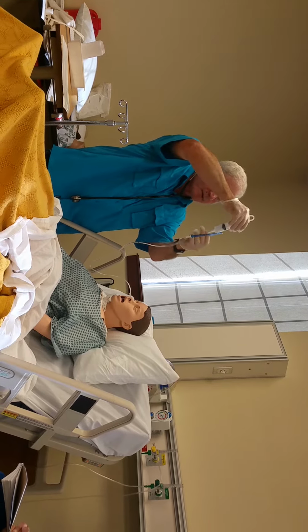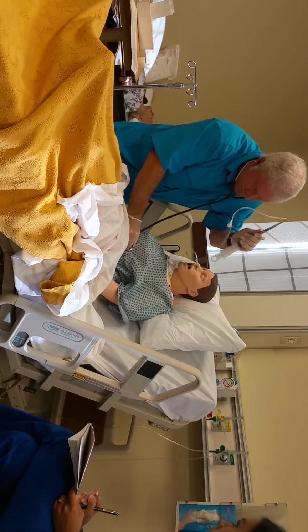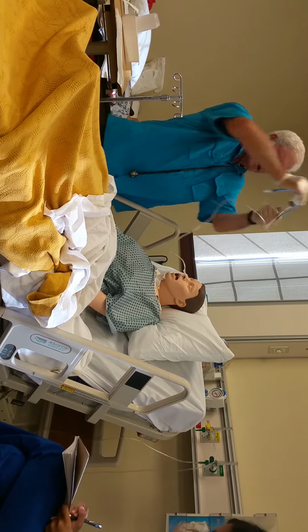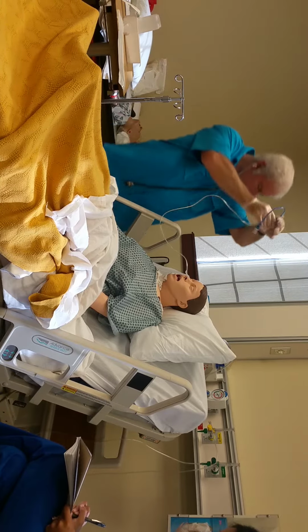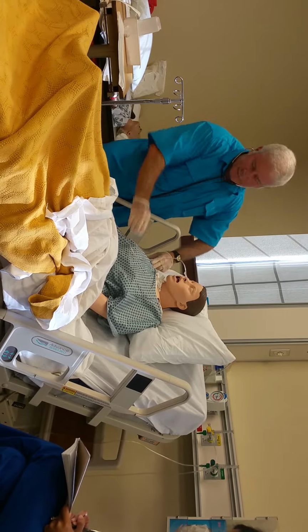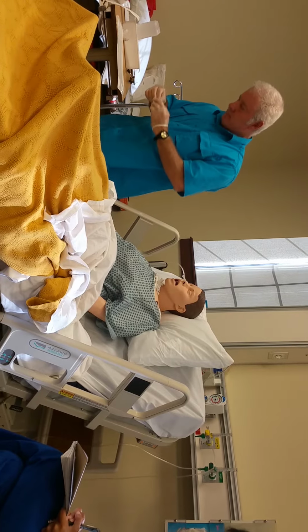All right? I get my stethoscope, put it right on the xiphoid process. I hold these two things together is the way I do it. And then you want a brisk push. Okay, I heard air, so we're good to go. I want to keep this up still. Set that down. Bam, put the suction. Then I'm going to make myself a flag.